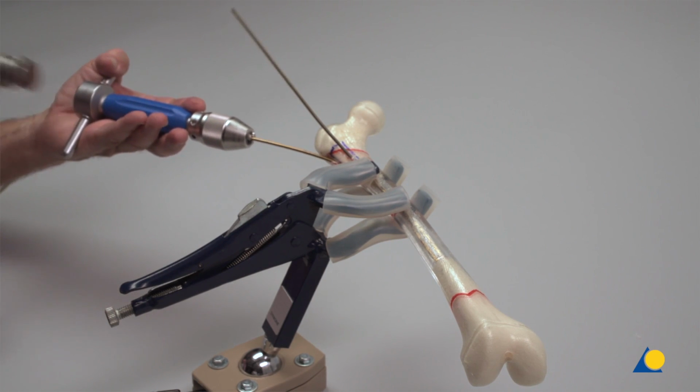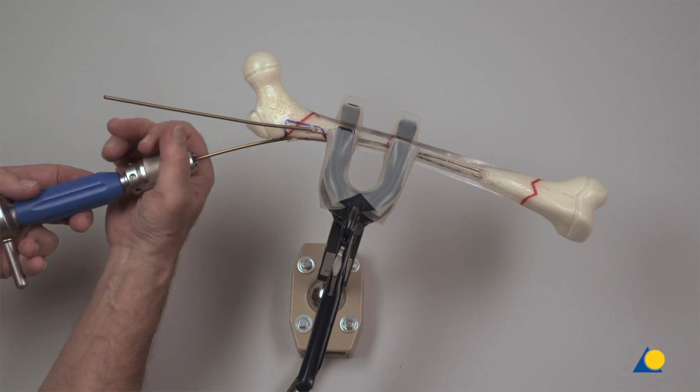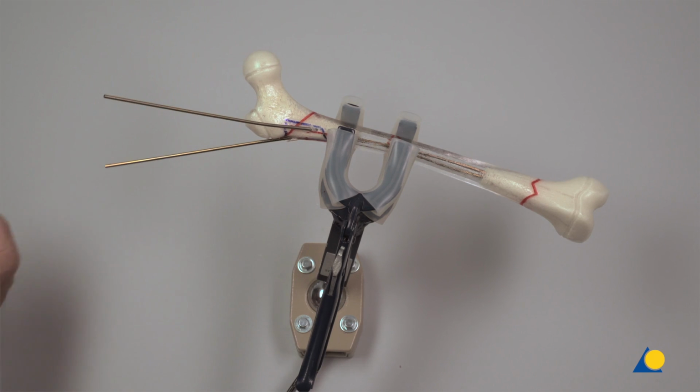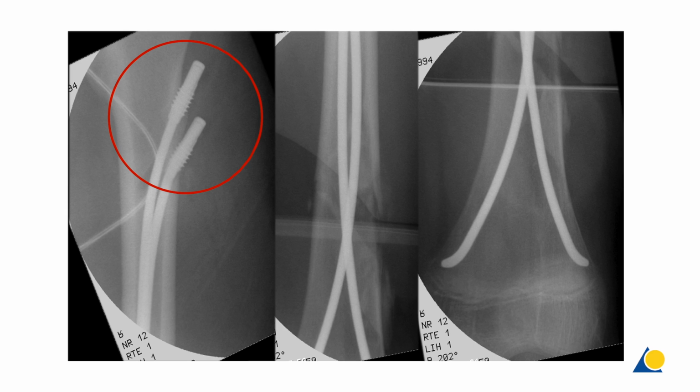Once the fracture is reduced, the nail is advanced into the distal fragment of its respective condylar region. If the distal fragment is short, a single perforation of the physis is possible. This does not cause any growth disturbance. The inserter is removed. The nail tips are aligned in order that they are divergent. The external parts of the nails will be cut in the same manner as previously demonstrated. End caps can also be used in the antegrade technique, as shown in this clinical case.